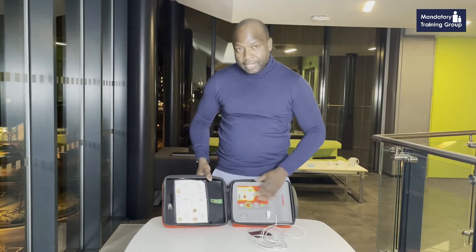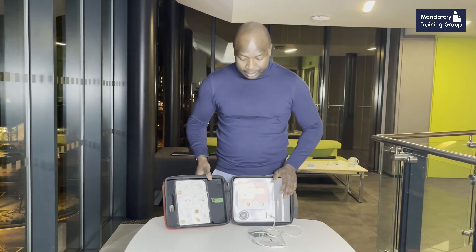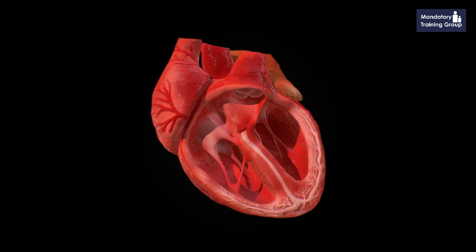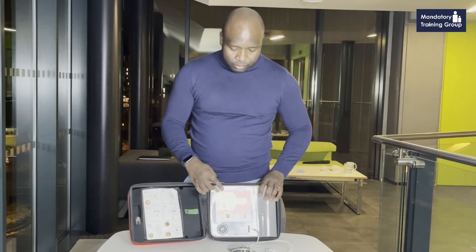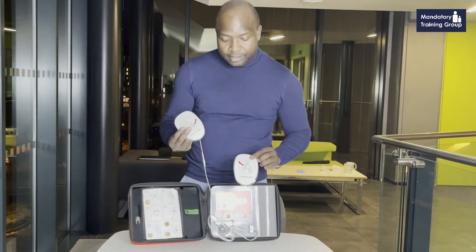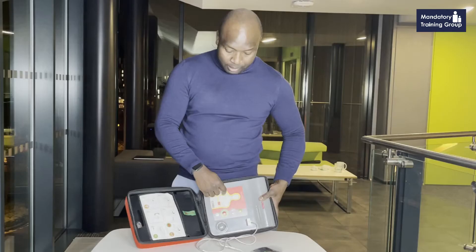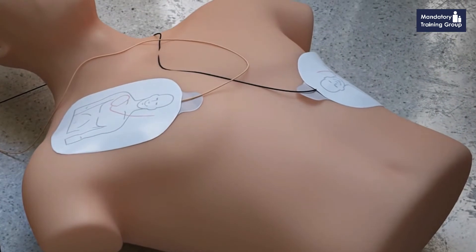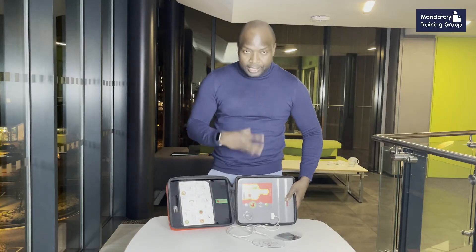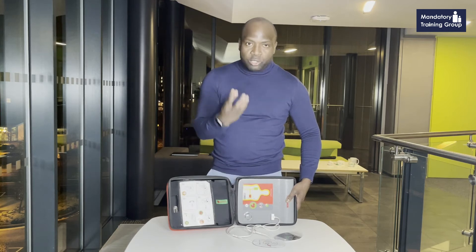The idea with an AED is that it delivers a shock to the heart. We put the pads on — these pads have to be placed onto the chest and under the armpit on the left side, as shown here. One pad goes to the right side of the chest, and the second pad goes just underneath the armpit on the left side. The heart is in between, and the AED delivers a shock from either side of the heart.